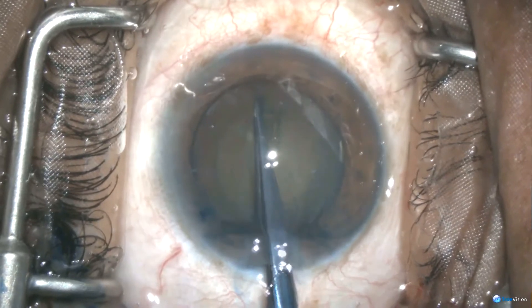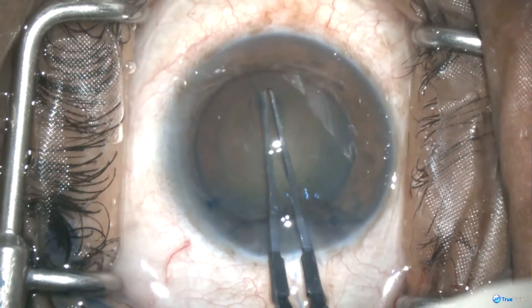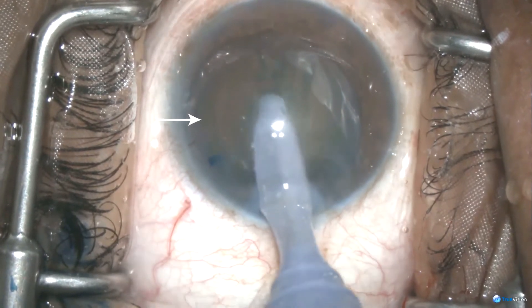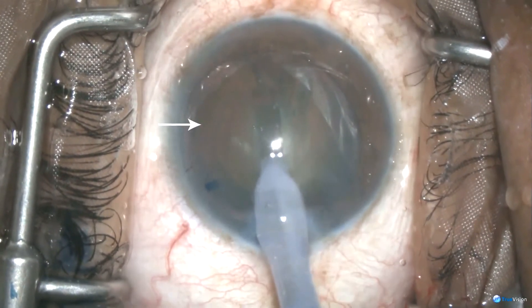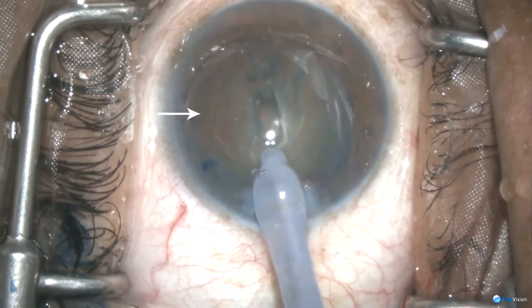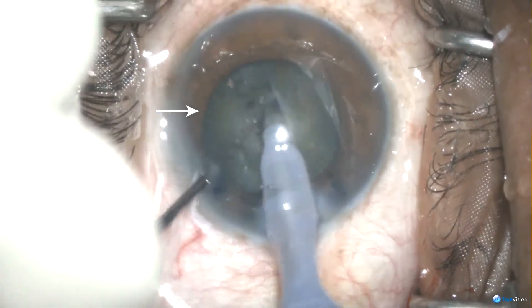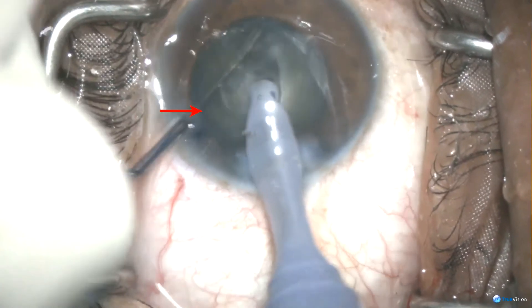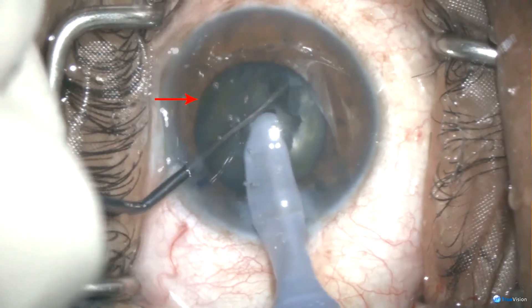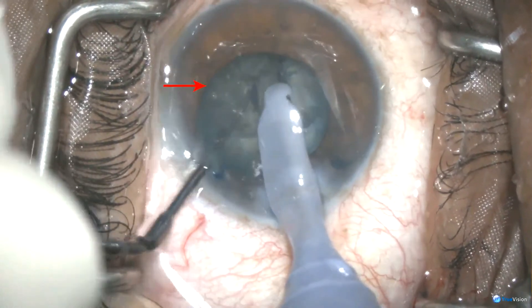In this second video of a resident doctor, capsulorhexis enlargement is being done. While sculpting, one can appreciate the fluttering of the capsulorhexis flap indicated by the arrow marker. This signifies that the anterior capsular tear has not extended beyond the equator. The surgeon attempts division of the nucleus. With the second attempt, the flap becomes flat and stops fluttering, indicating extension of the tear beyond the equator. The surgeon, oblivious of the significance of the flap motility sign, continued.